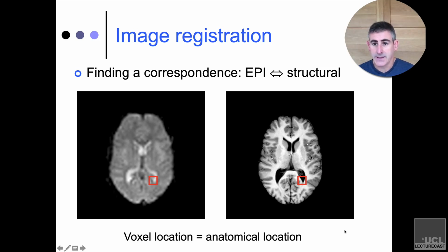And that is an image registration problem. That is to say, the reference in this case is the structural scan, the image that I'm going to affect is the functional scan, and I just want to make sure that it's in the same registration, same orientation, etc.